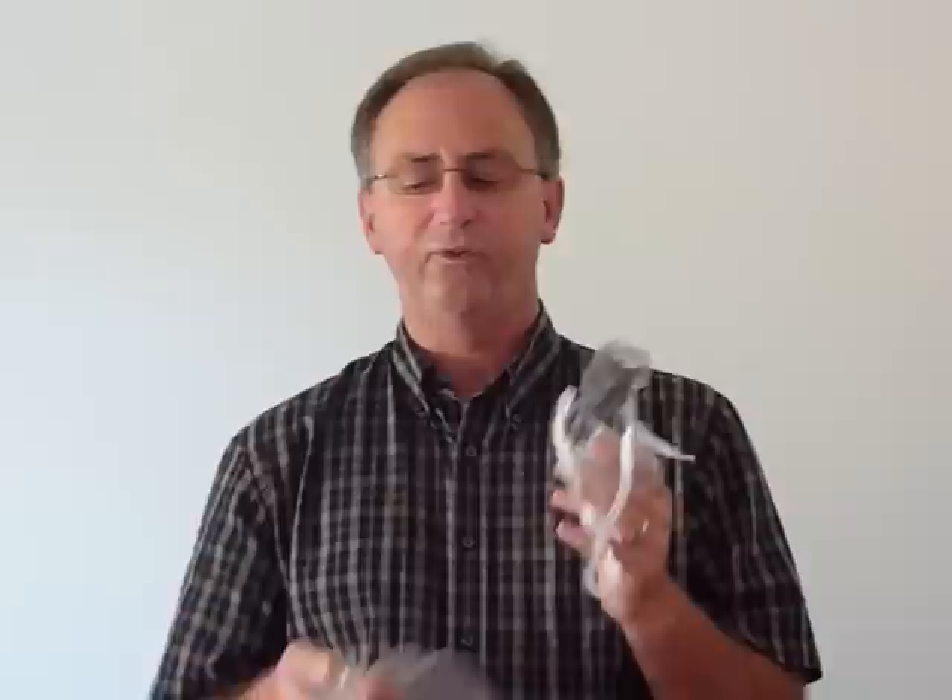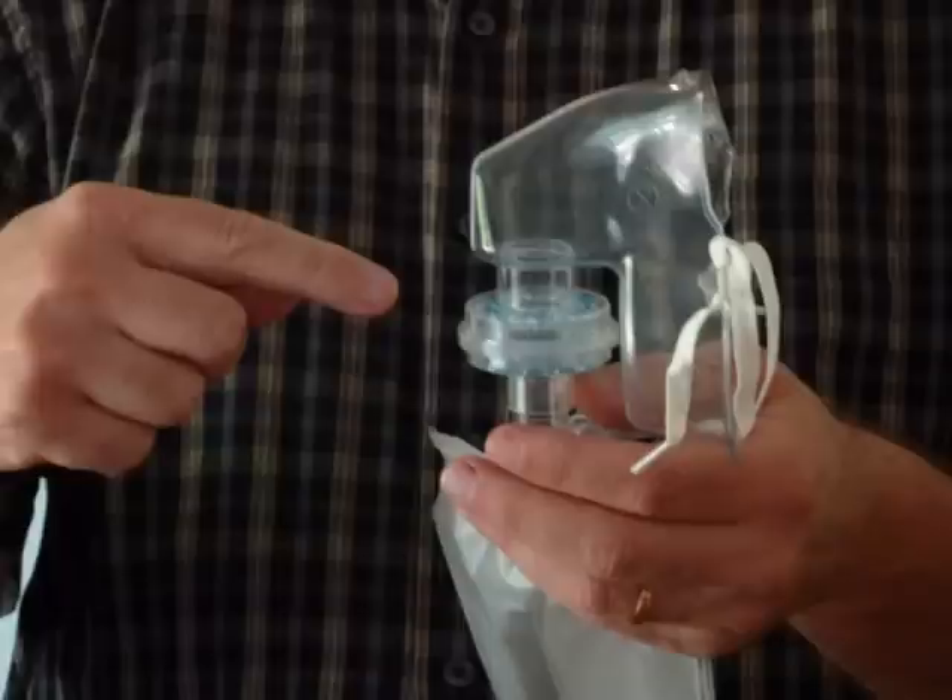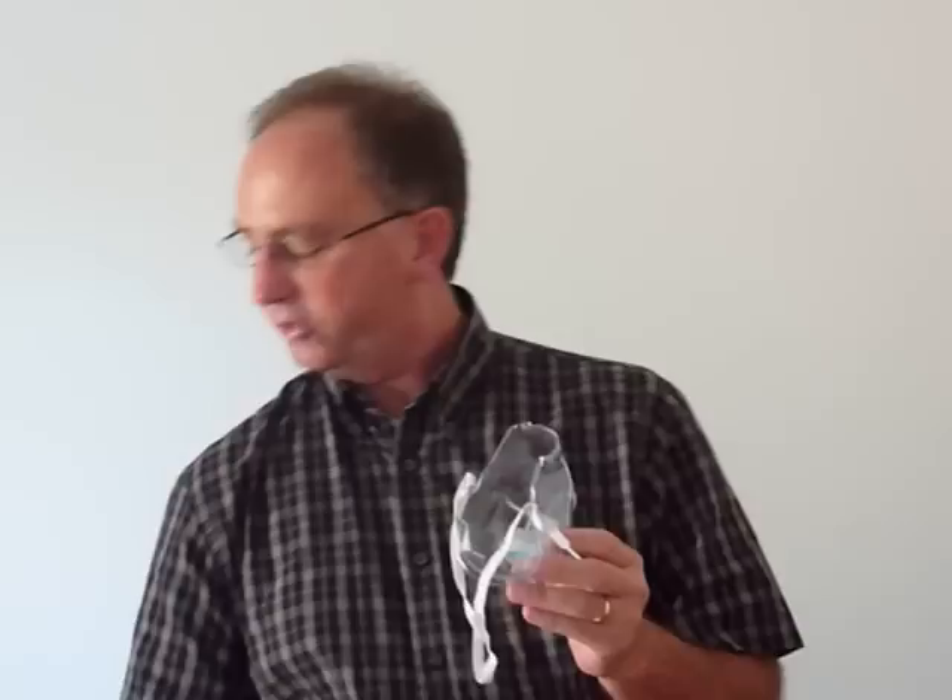So let's look at the first opportunity with the mask. When you first approach your patient, you notice that they're coughing — they may have a respiratory disease. You want to protect yourself, so you put this mask directly on the patient's face. It has two filtration systems so that when the patient exhales, it captures their particles so that it doesn't contaminate you, the rescuer.